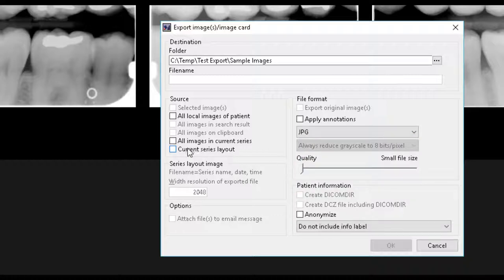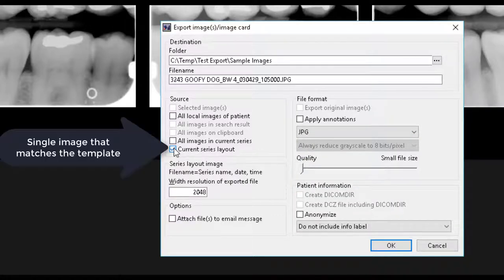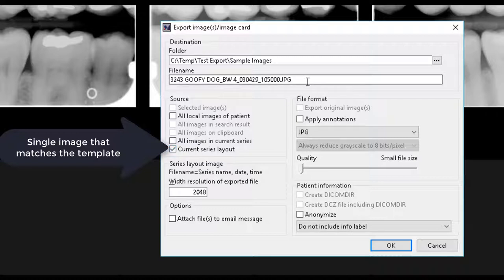The Current Series Layout option produces a single image that matches the template you are currently viewing.